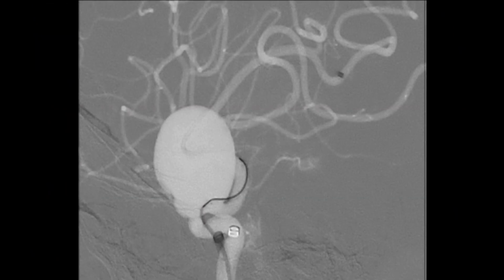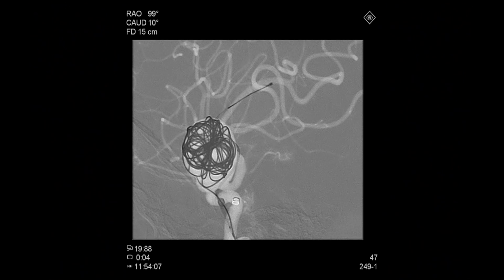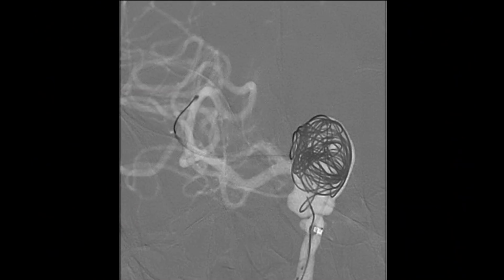After this, we decided to take in the flow diverter. Again, you can see slightly unstable microcatheter. With careful manipulation, we could take it ahead. Then, using a coiling microcatheter, we coiled the aneurysm partially. The loop near the neck was in the lateral lobule, not in the parent vessel.